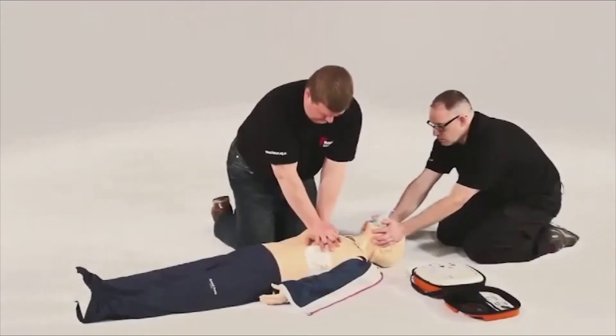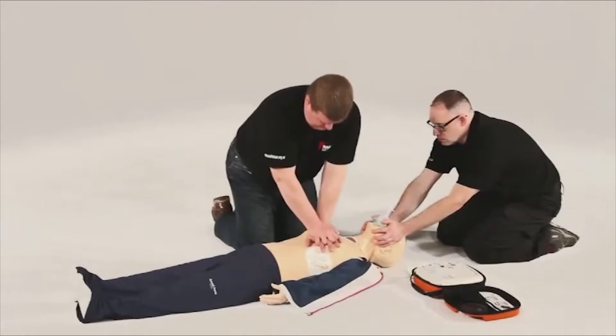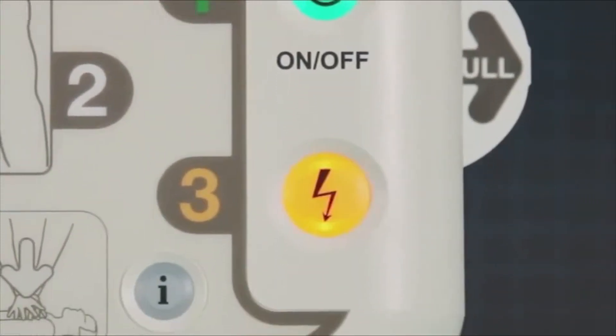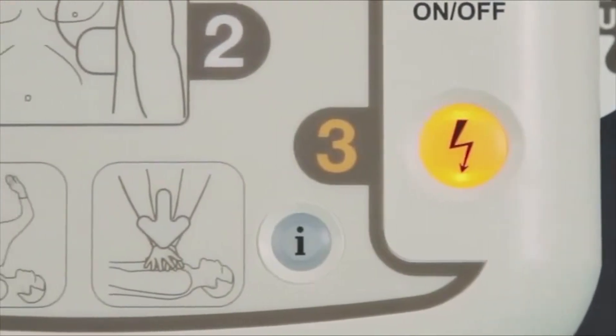If you choose not to press the flashing blue I button, the iPad SP1 will verbally tell you how long until it reanalyses. This will be repeated at regular intervals.